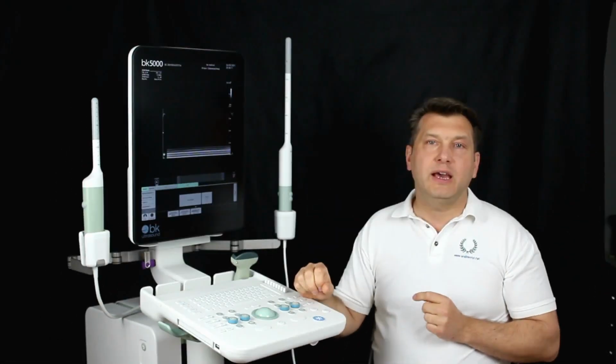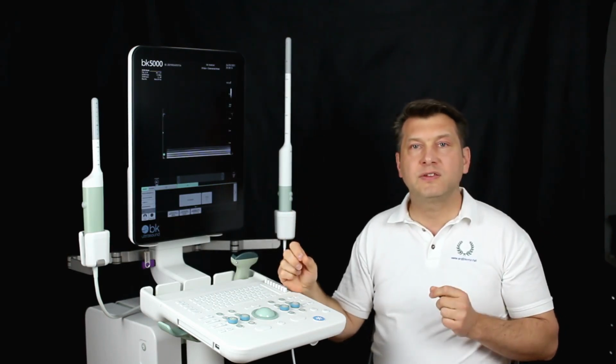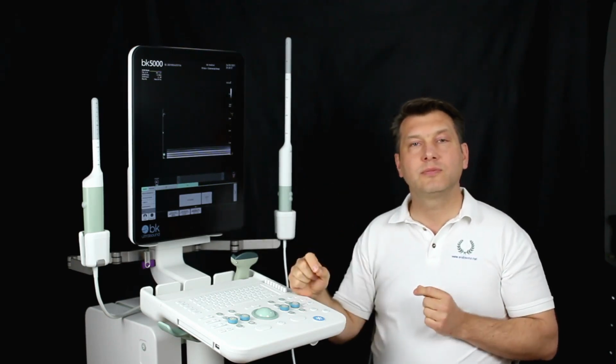As we see, it is not difficult to choose the right parameters for the 3D sonography. This is how your diagnostic will surely be successful and reliable. Thank you very much.